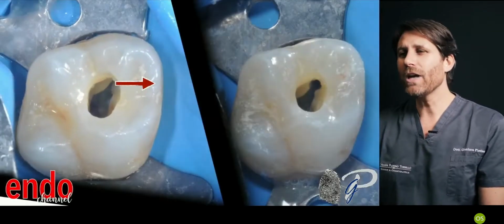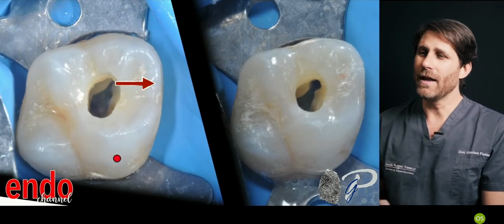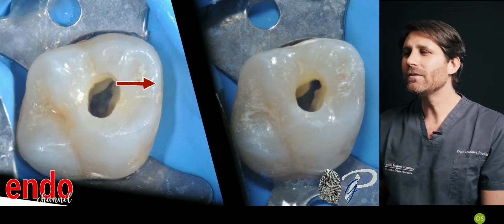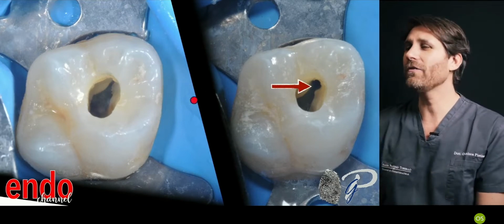And we have to shape this by saving the enamel, the oblique ridge of the upper molar and the mesial marginal ridge, but we need to have access to all the root canal anatomy. So we need to visualize the orifices and to prepare.